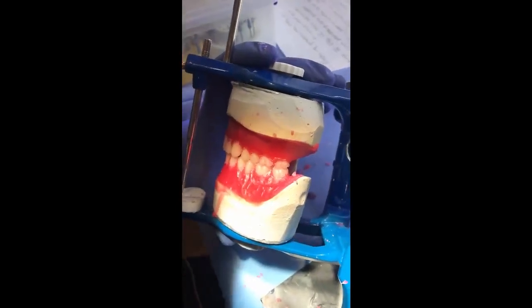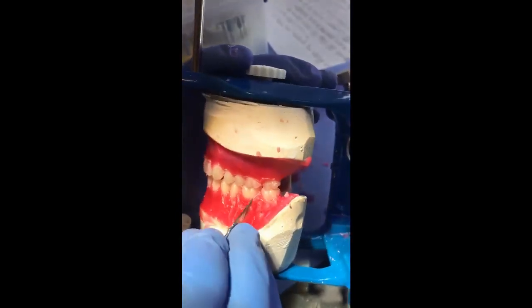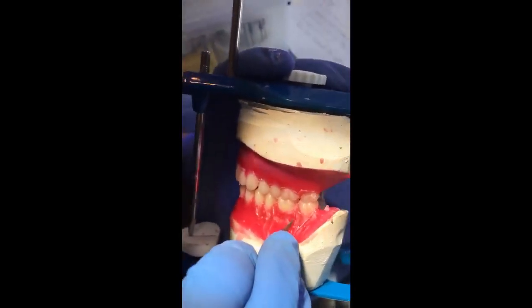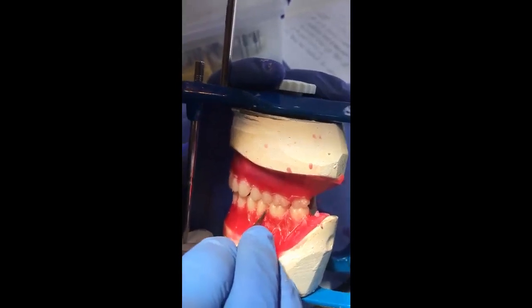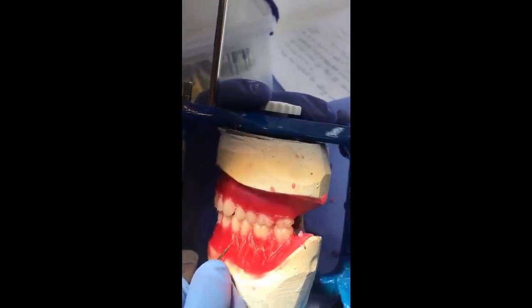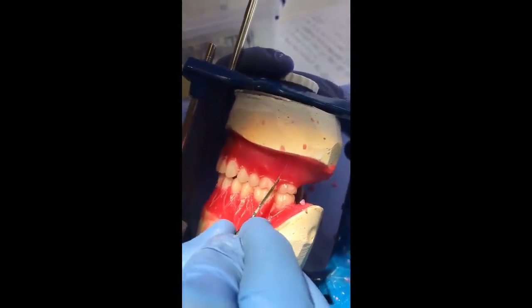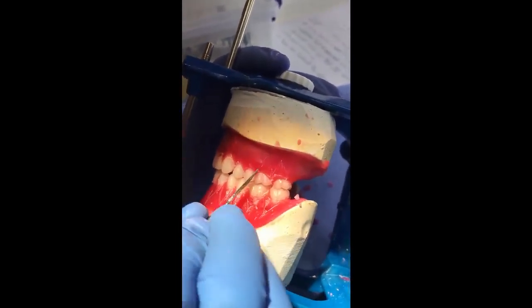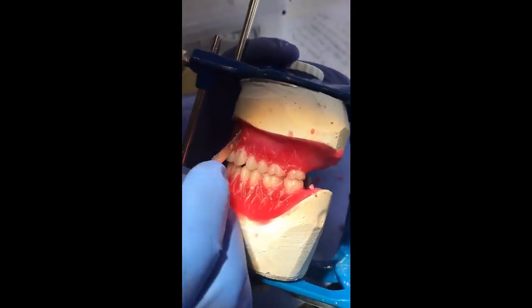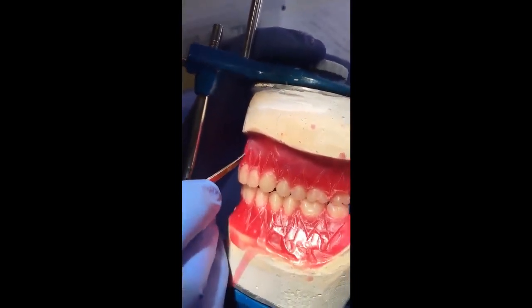Now after that we are going to create the root bulges around the teeth. We draw triangles in this form. These triangles coincide with the area of the root, and here in the upper triangles around the roots. The triangle over the canine will be higher as the root of the canine is longer, and around the lateral it is shorter.